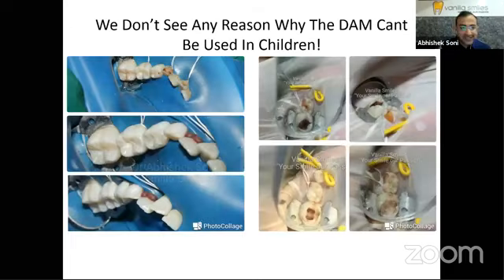We are so overzealous now that there was a time when we did not have a rubber dam sheet and we ended up using a latex glove as a rubber dam sheet.